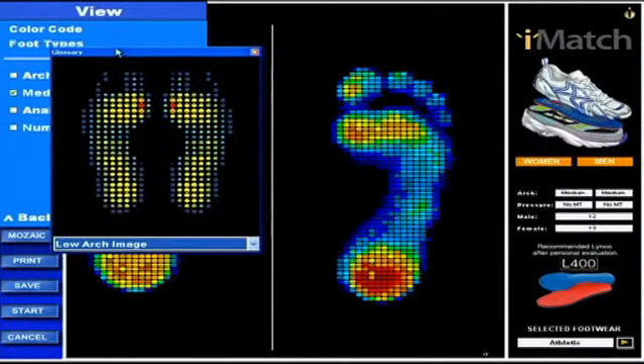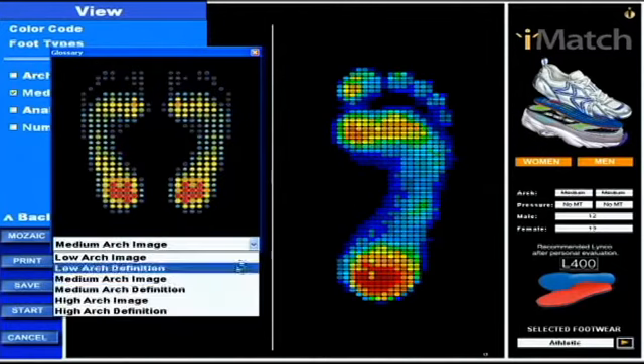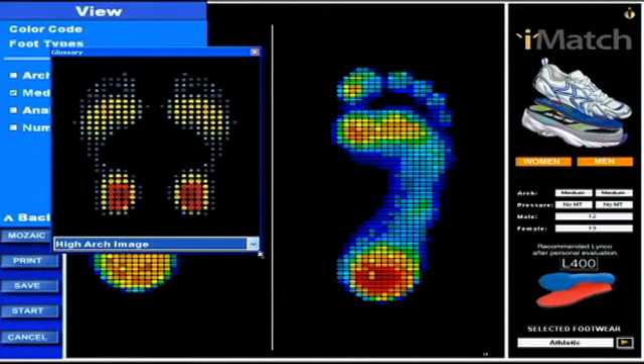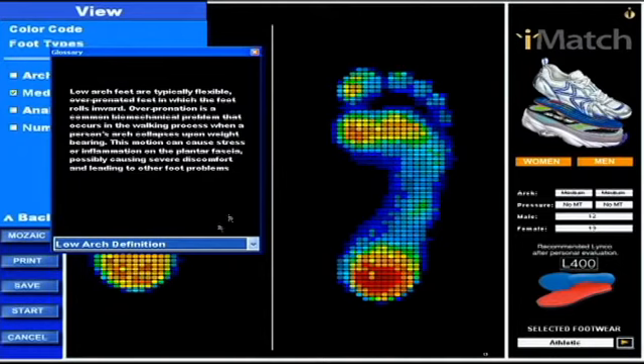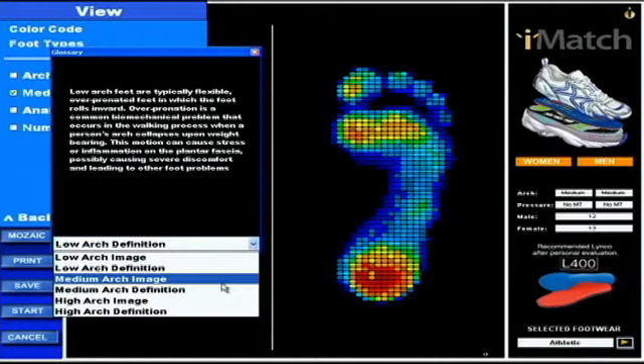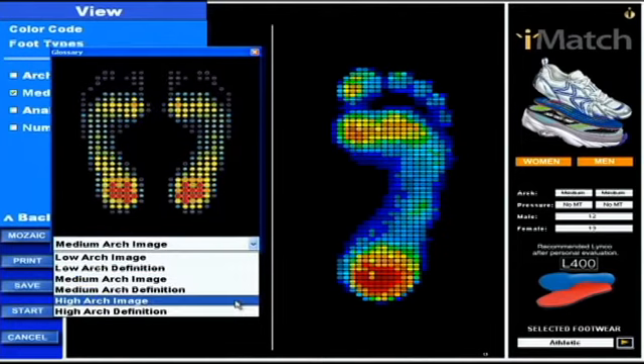The next is foot types. What foot types does is it shows you a typical low arch foot, a typical medium arch foot, and a typical high arch foot. The other buttons within this field are definitions — so this is a low arch definition, what a low arch foot would typically look like, that it's over-pronating. There are definitions for medium and high arch as well.